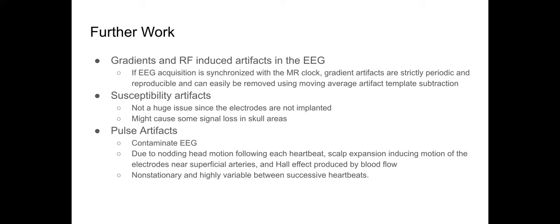And this is because biomechanical motions are very variable. This artifact is non-stationary and highly variable between successive heartbeats. So it's not easily removable like gradient-induced artifacts are. Next slide.